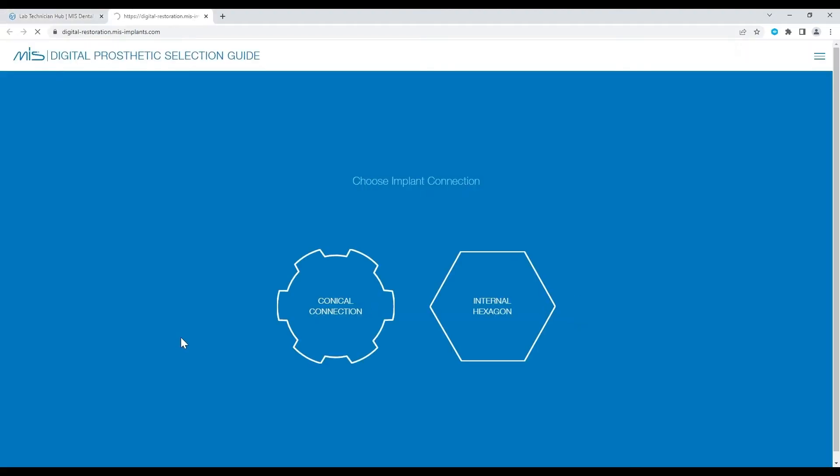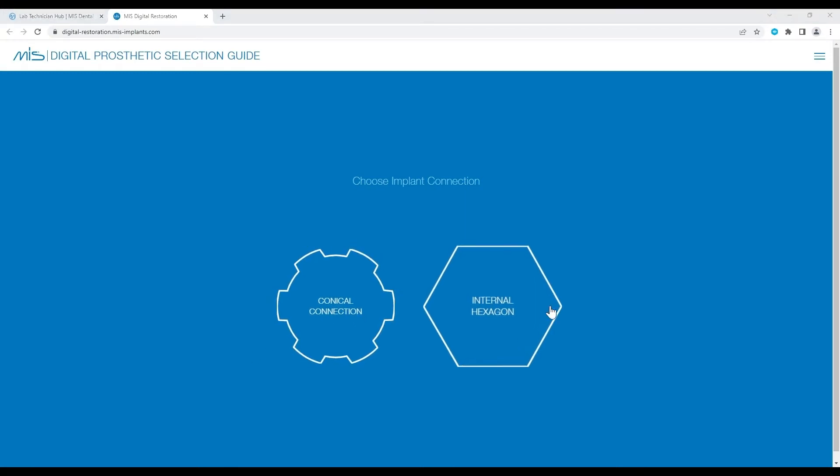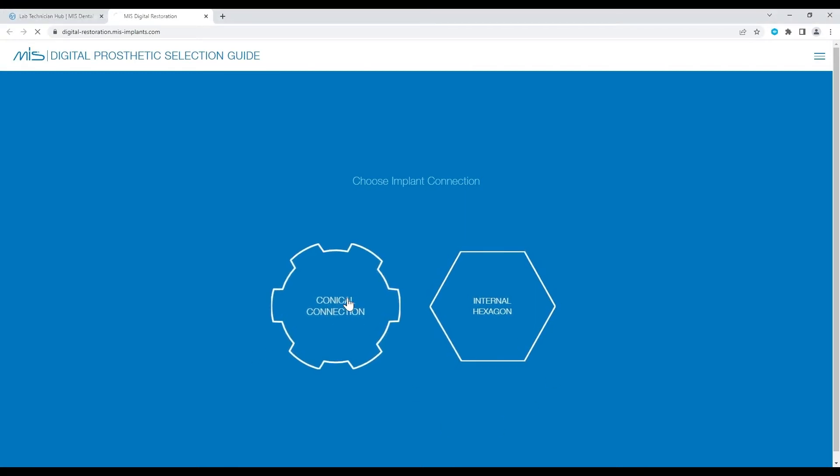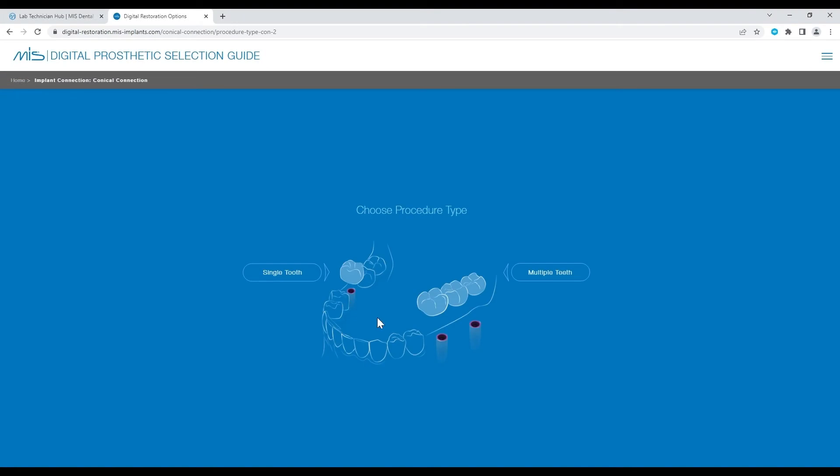We start by selecting the internal implant connection. In this case, I click on Conical Connection. Next, we choose the procedure type, single tooth or multiple teeth.